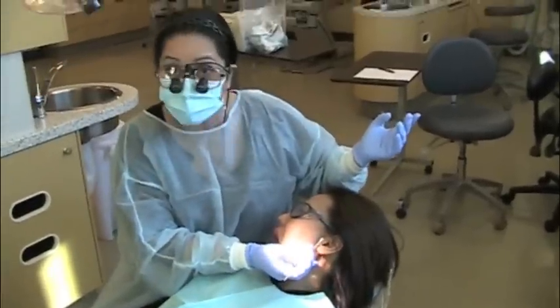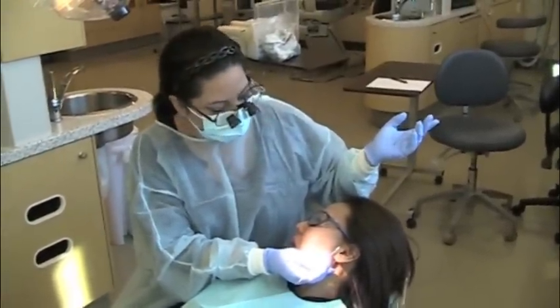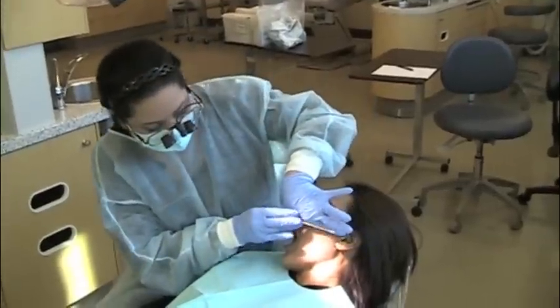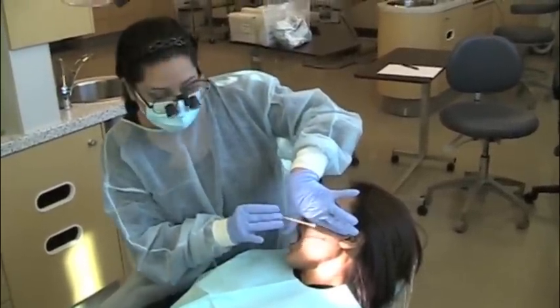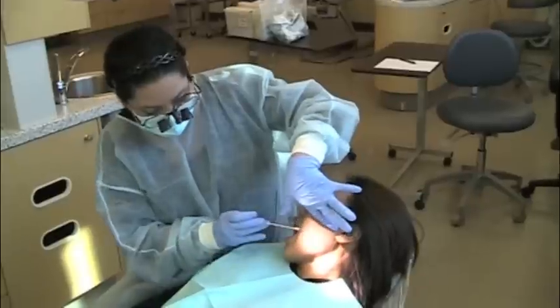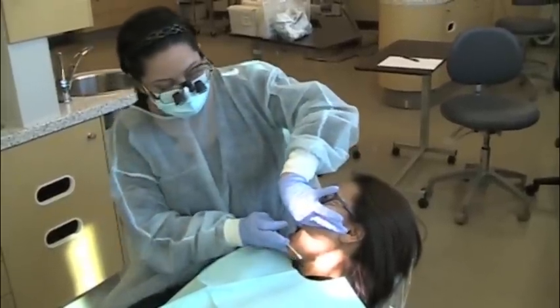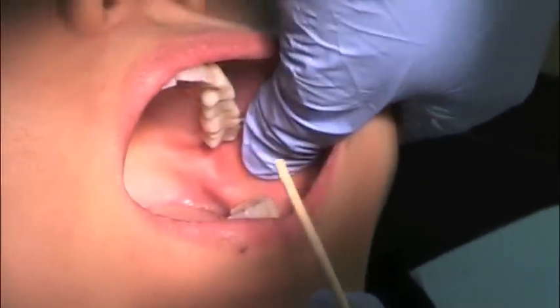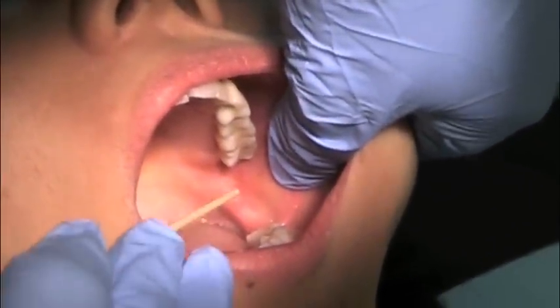First, identify the tragus of the ear. Place the index finger at the neck of the condyle, right below the tragus. Create a line with the index finger to the corner of the mouth. Retract the cheek with the thumb without losing the index finger landmark.